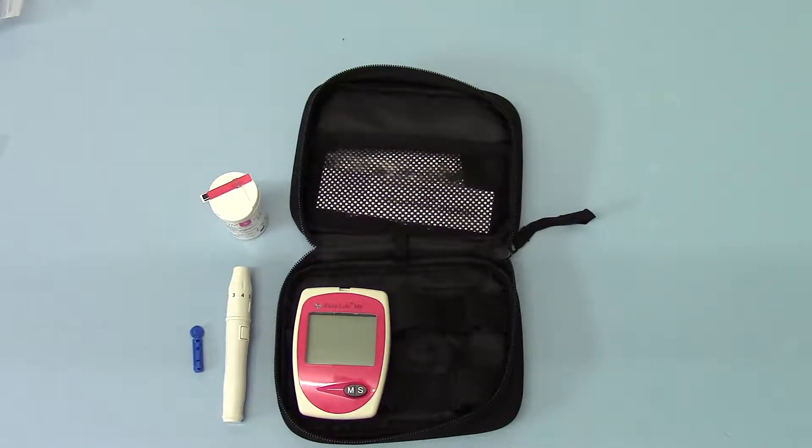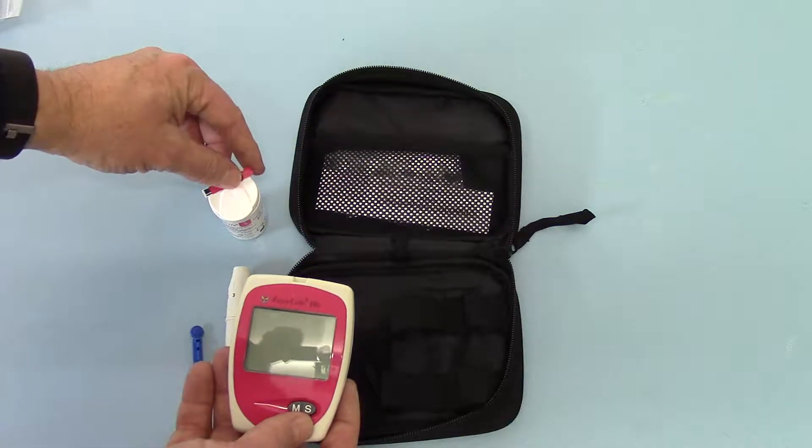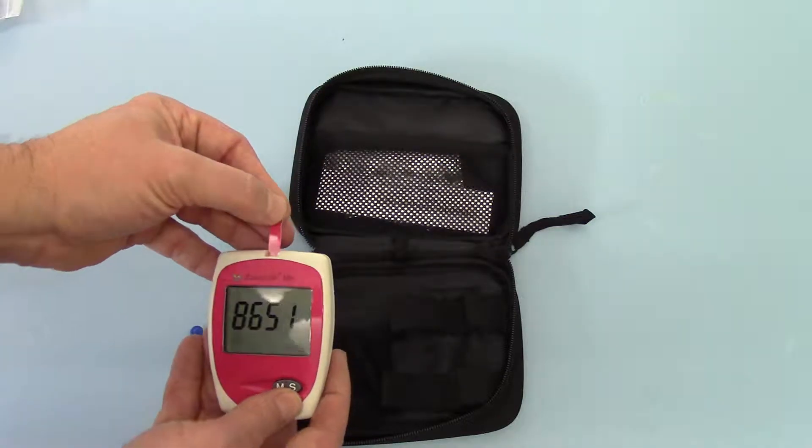Welcome to this product demo where we're going to show you the correct procedure for doing the finger lance and applying a sample to the test strip in a haemoglobin meter made by Easy Life. In the first part of this video that you may have already watched, we've set the meter up with the batteries and it's all ready to go. To power up the meter, all you have to do is apply a test strip into the top port.